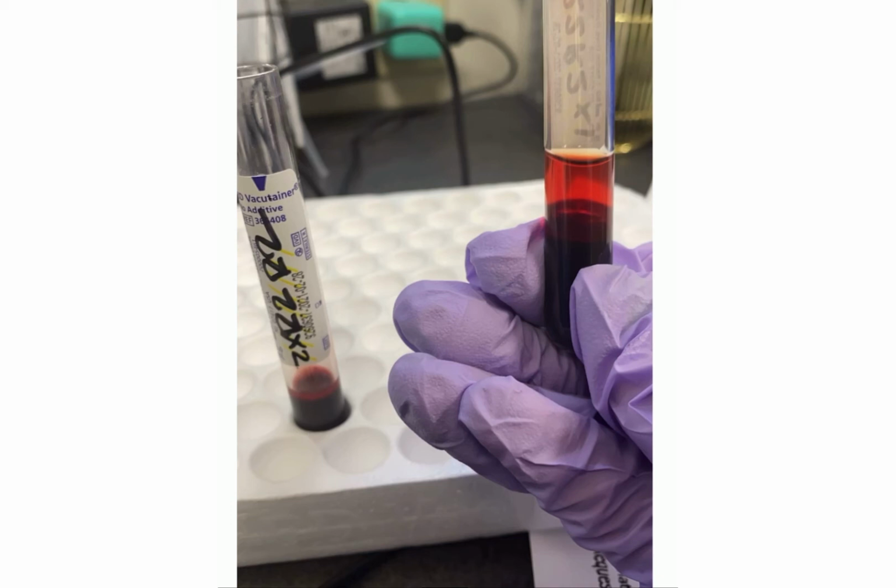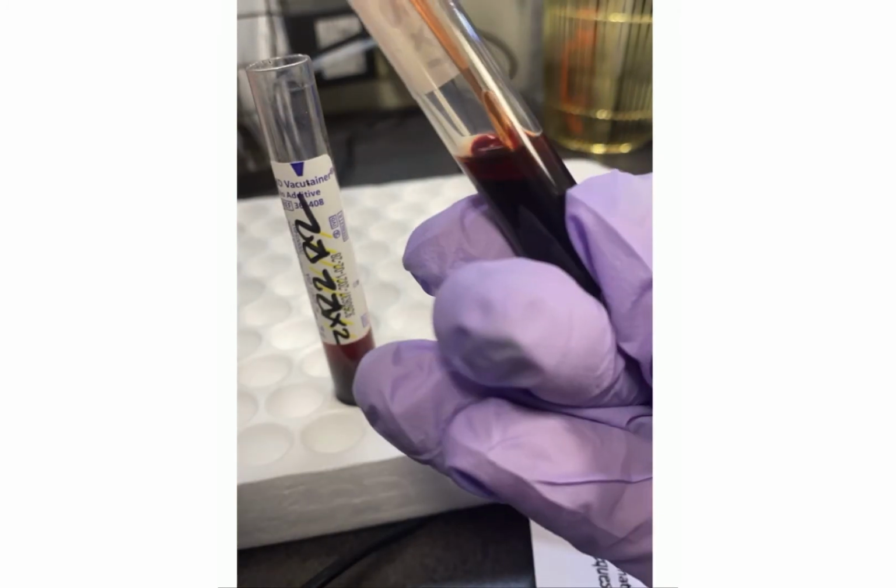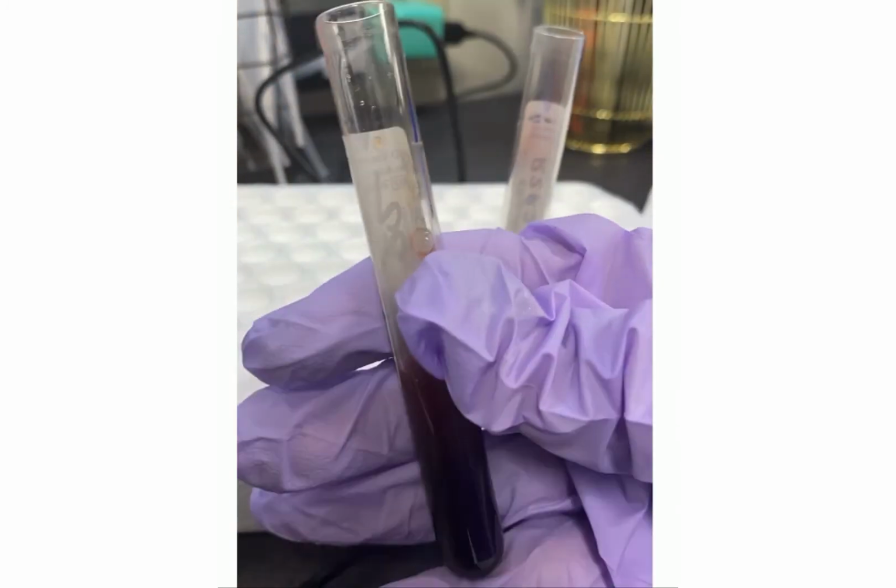So in this video, I'm demonstrating taking the R2 times 1 adsorbed plasma and adding it a second time to incubate with even more donor reagent red blood cell exposure to remove that very strong autoantibody. So I'll just simply remove the adsorbed plasma from the times 1 procedure, and then I'll add it to my second tube to begin my times 2, and I'll mix.